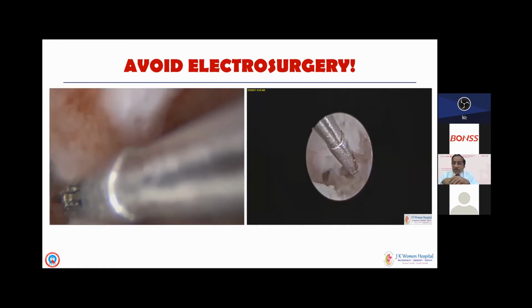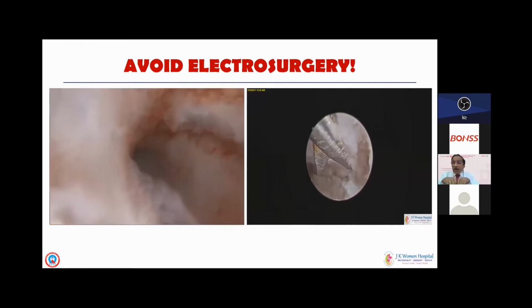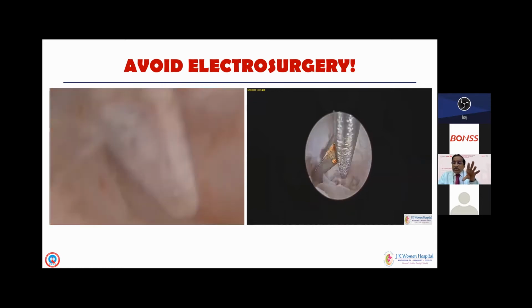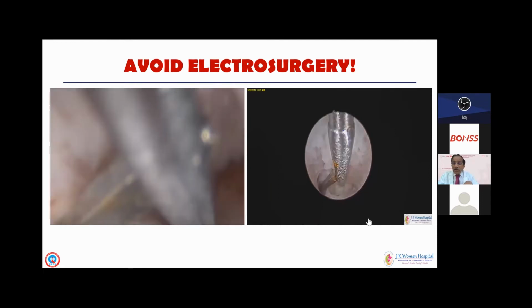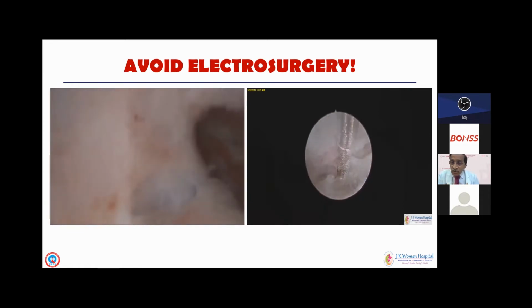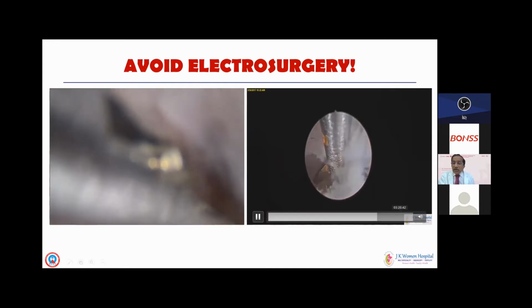Starting with the central adhesions, you know that the hysteroscopic uterine cavity is an inverted triangle with the tip at the internal os, and you can very beautifully cut all the different adhesions with the scissors itself. Here you definitely do not want any sort of energy because you can see that the endometrium is already damaged, and you would be happy whatever endometrium grows, and we do not know how much will be the thermal damage to the endometrium if at all we have to use any sort of electrosurgery.